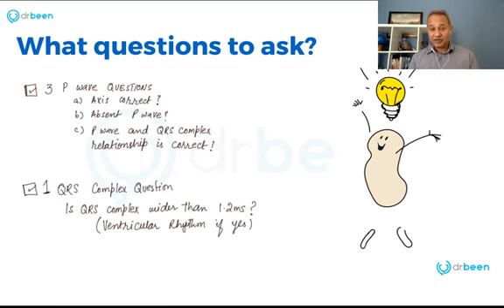P wave is your friend in this situation when you are expecting a rhythm problem. So before we talk about it, keep this in mind, that a normal sinus rhythm means P wave starting from the atrial depolarization, then QRS complex indicating ventricular depolarization, and then T wave indicating ventricular repolarization are the normal structures present in the EKG.